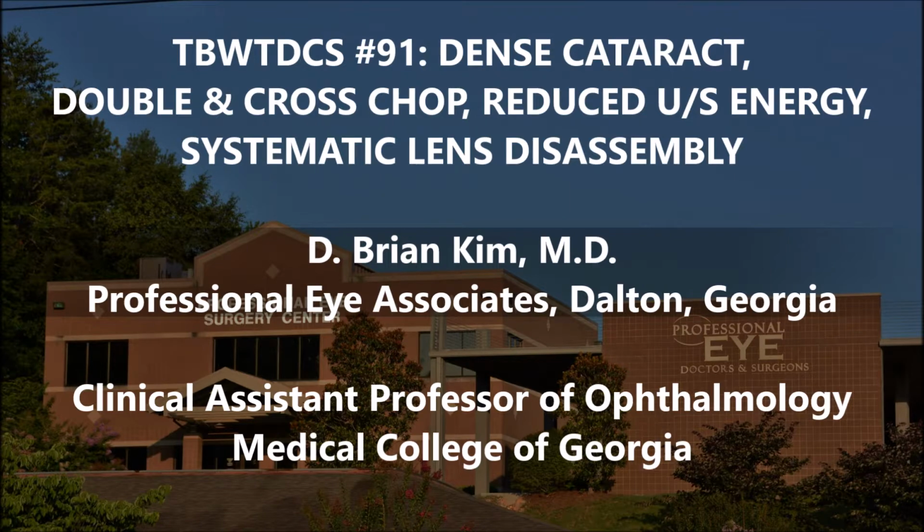You have heard me say many times that with dense lenses, you can utilize a lot of ultrasonic energy, and that can lead to corneal edema. You could have a higher risk for grabbing the posterior capsule with these maneuvers. By using mechanical forces, you're able to reduce the use of ultrasonic energy and keep away from the posterior capsule while you're disassembling the lens.